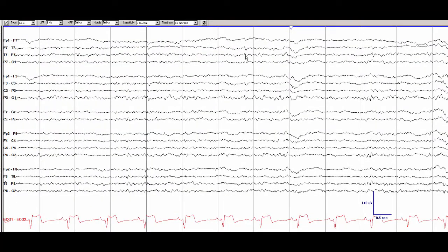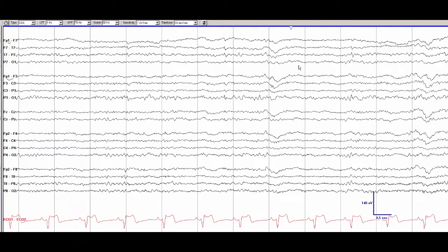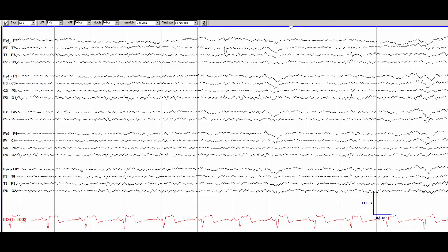Once you notice this you might notice that there are a few more. One just before it and one just after it and probably one independently in the right temporal region. We can see that it has a broad field. It seems to have maximum electronegativity at around F7 but also with a field that extends to F3. There is nothing in the contralateral hemisphere with this one.